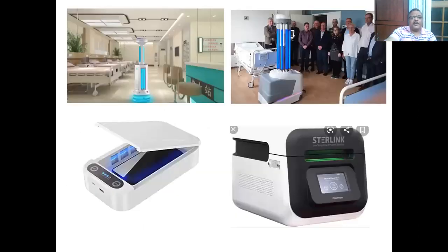These are some of the things that I have recently noticed, because in Hindi we say that necessity is the mother of invention. So these are some of the new products that have come in the market. This is an ultraviolet source. We can use it to sterilize the hospital, the offices.